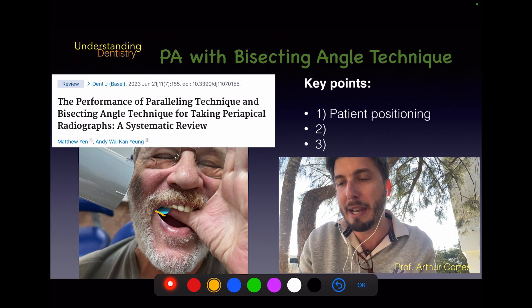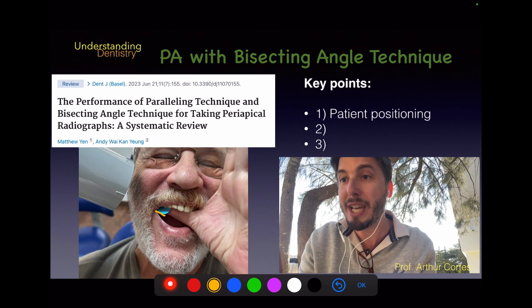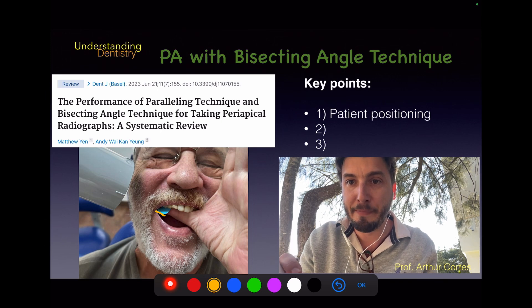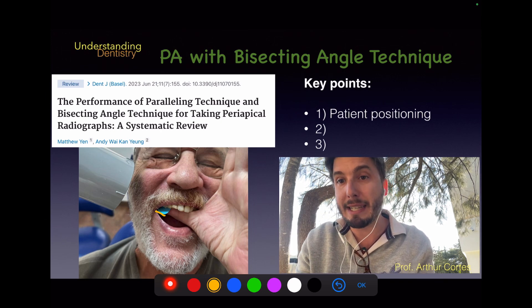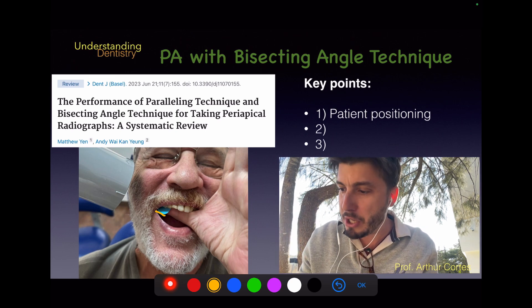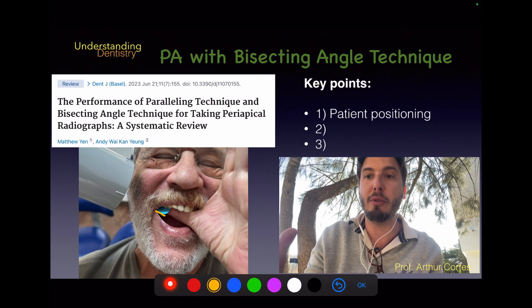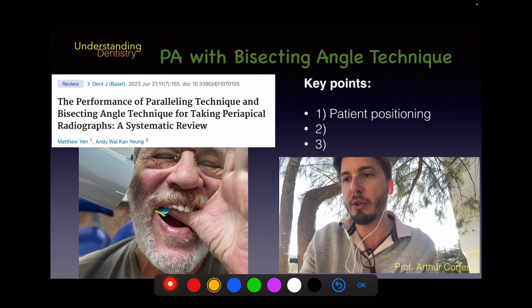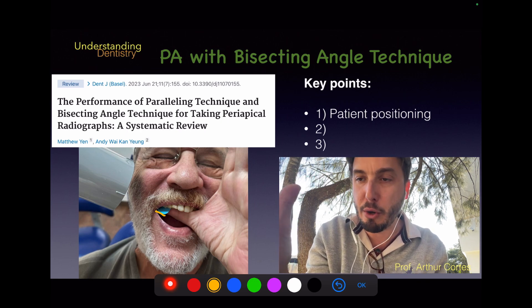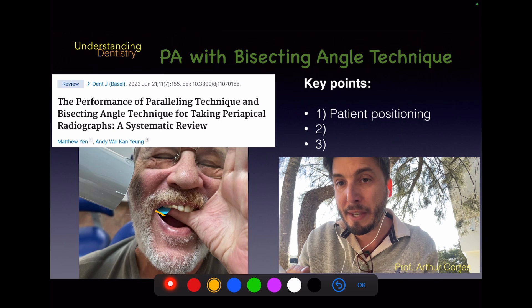There is a curve of the hard palate, and the film will bend as the patient pushes it toward the teeth and hard palate — that's absolutely normal. This is something to take into consideration when choosing the angles, which we'll discuss shortly. After you position the film with your hand, you help the patient bring their opposite-side hand to hold it. For example, for the left side, use the patient's right hand.